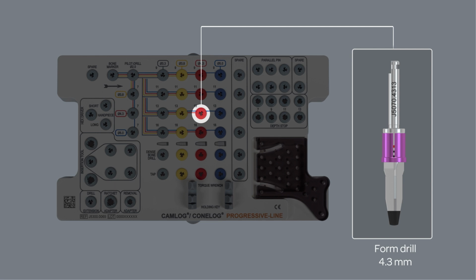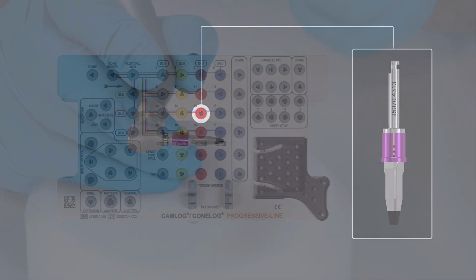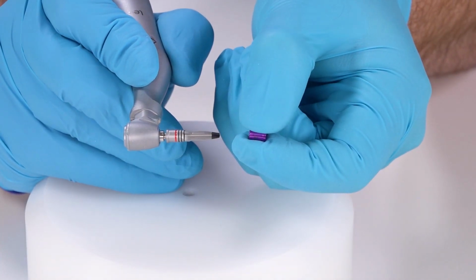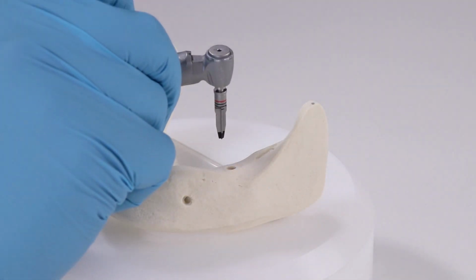Form drilling 4.3 mm. The CONELOG progressive-line implants Promote Plus are placed epicrestally. To do this, final form drilling is performed without depth stop and to the upper edge of the first filled depth mark.